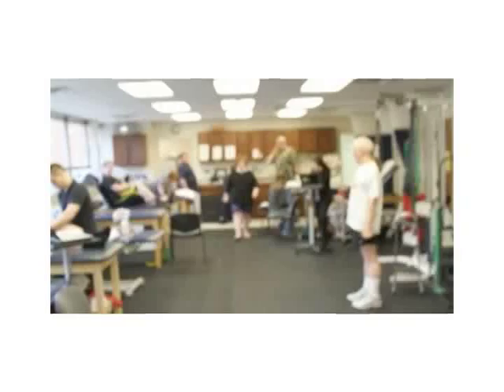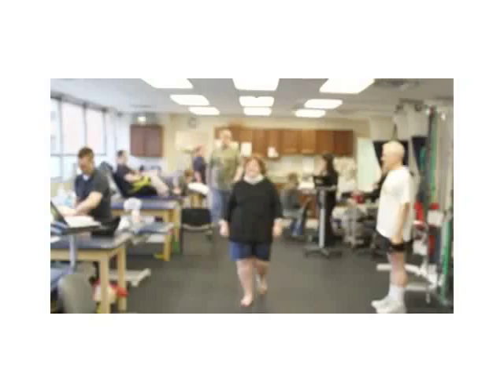We did the viscosupplementation. Nothing was working. And she, you know, could not get off of the pain meds and the walker. And about 3 months post her scope, she said, "You got to do something. I don't want a total knee." She wasn't a candidate for it because she had preserved joint spaces. So we ended up resurfacing her. And she's done fairly well. She's at more than 8 months now. She's probably at about 22 months now, but this video was taken when she was at 8 months.